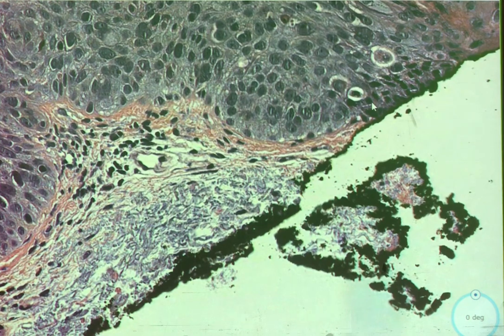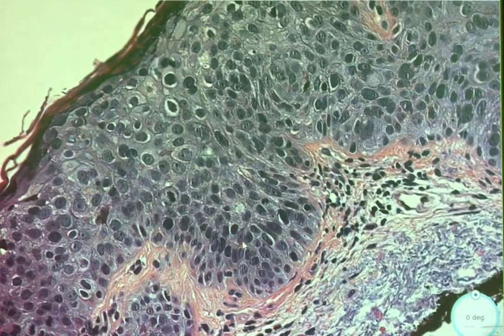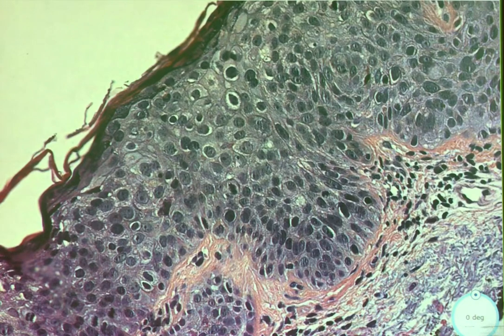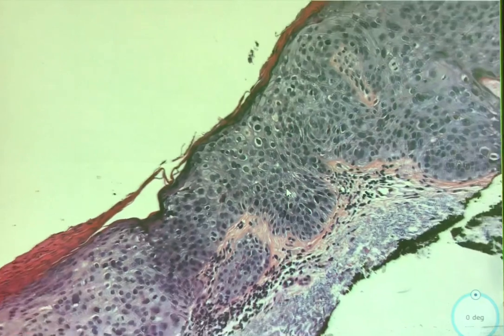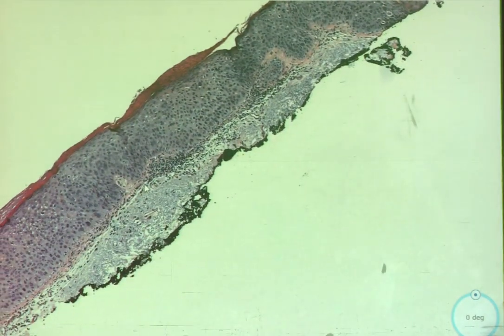But let's just say everything looks like what we have here, and they complete their excision like they should, and there's nothing in the excision. So what do we actually have on this slide? Is this invasive or in situ? Pretend that area doesn't exist. So it's in situ. I will accept that, even though we haven't looked at all the tissue, for the sake of time, and mostly because I set up a presentation. This is carcinoma in situ.